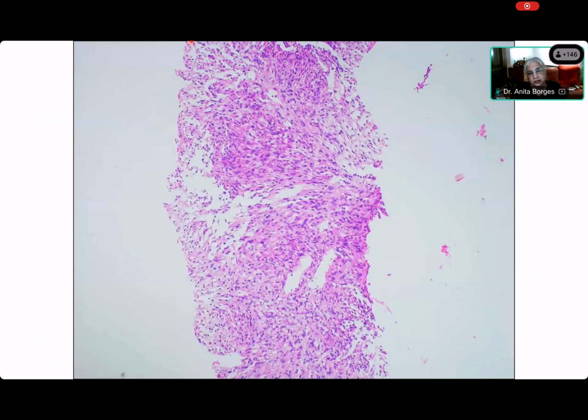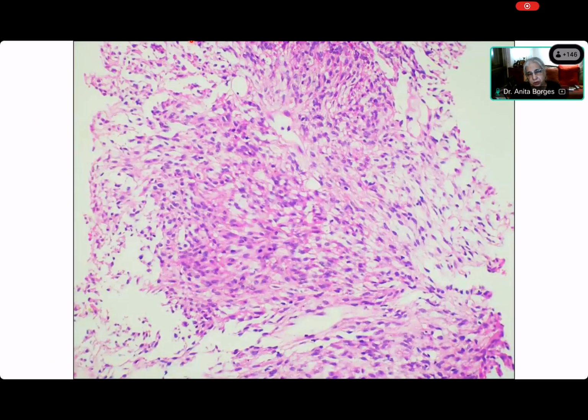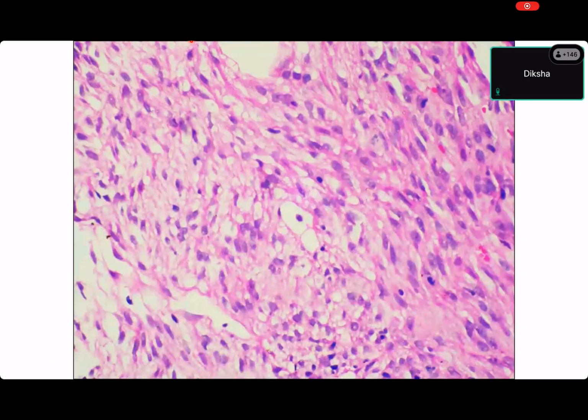Is this spindle shaped? This is a spindle cell tumor, right? Yes, ma'am. The needle core biopsy, yes. Is this also a spindle cell tumor? Yes, it is spindle cell. Does it look like the tumor that was there in the spermatic cord? No, ma'am. It doesn't look like the tumor in the spermatic cord. What do you mean? It's not spindle. It doesn't have blunt edges of the nuclei.